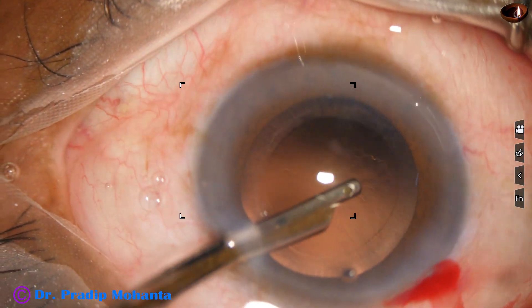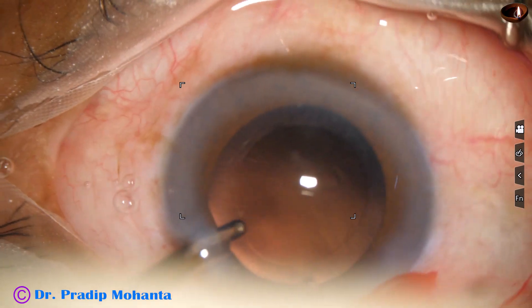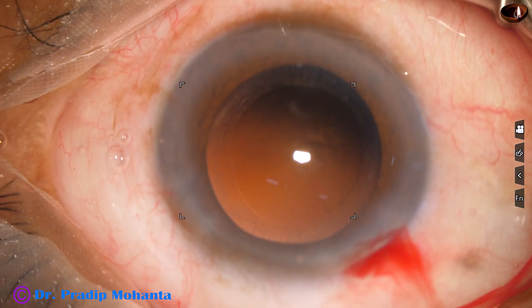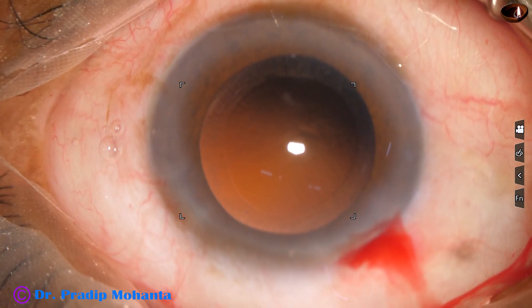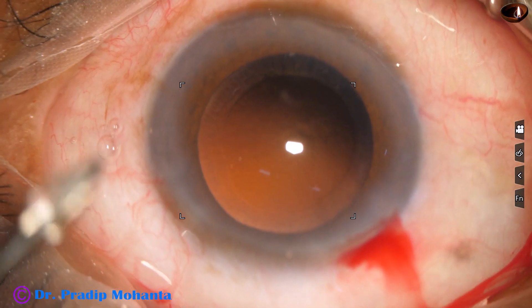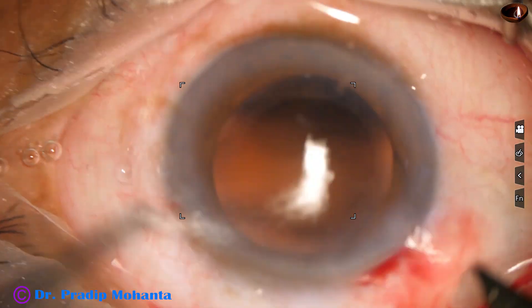Cortical cleanup is done. We can see the pseudo exfoliation material on the anterior surface of the anterior capsular rim remaining near the pupillary border. We do not have to do anything with this.